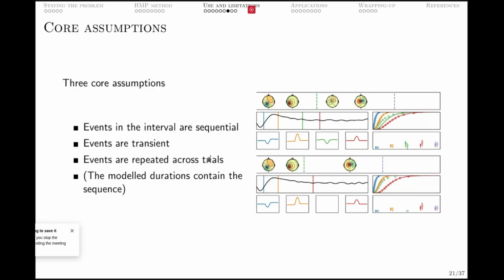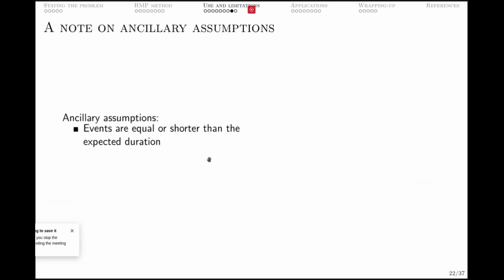And for the trials that are longer than the epoch size that you chose, you will miss some of the events that are happening outside of this window, right? So even though it's theoretically possible to just use a fixed length epoch, this is actually not something we advise, because you're not certain of where things are happening in time, and thus also not what the estimation you do is worth, because you don't have a reference for this sequence.